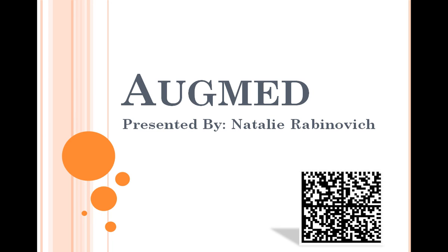Within this video, I will focus on its technical design and provide a short demonstration of AugMed's functionality. To obtain a broader understanding of AugMed and the motivation behind it, please watch the overview video.